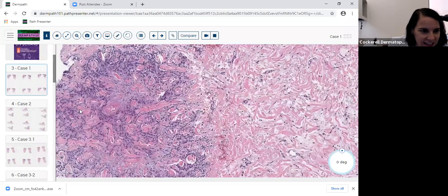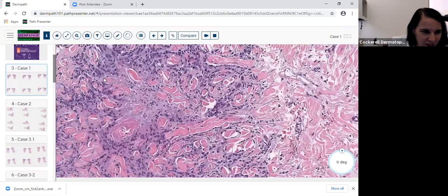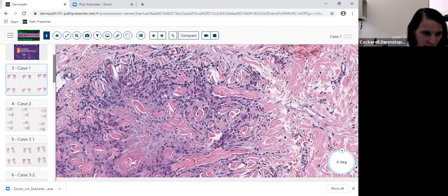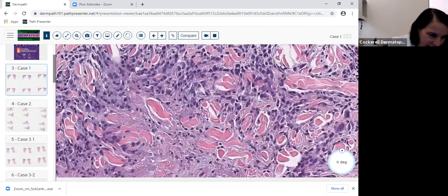You're seeing these collections of cells, and these collections seem to be surrounded by this central area that's somewhat lighter, feathery, granular, and blue. Also, you notice the entrapped collagen in this area. So right away, you're saying, well, these cells don't look malignant. They have a lot of cytoplasm.